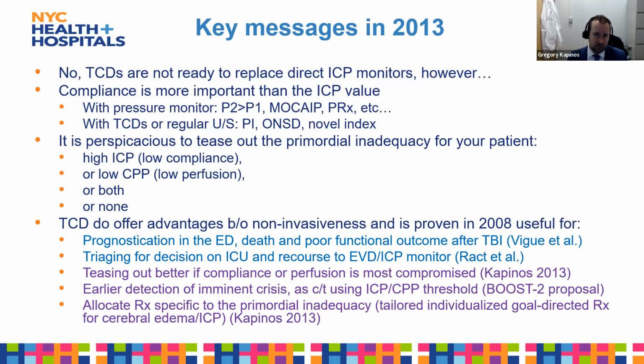My key messages at the ANS also, because usually I cannot get the attention of people to pay attention to that novel technology called Transcranial Doppler for too long, I was saying, if you remember only this slide, it would be this. Please use TCDs for those purposes.